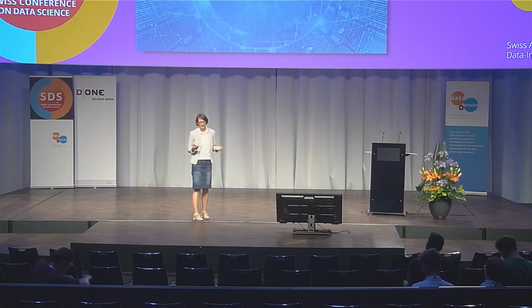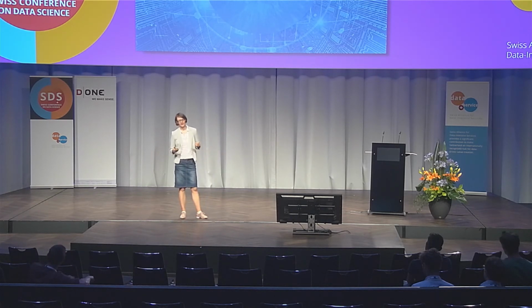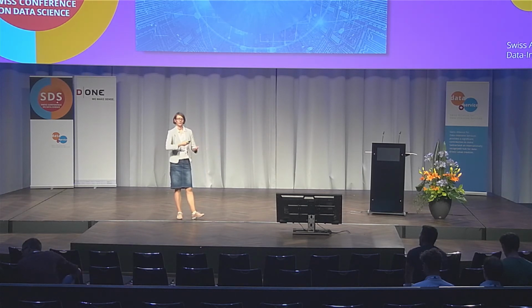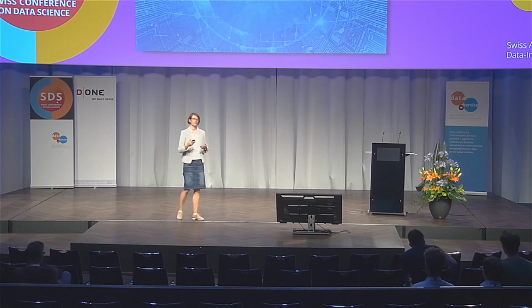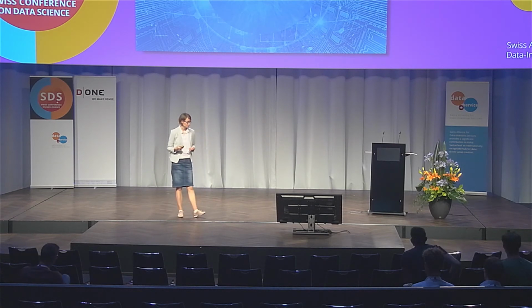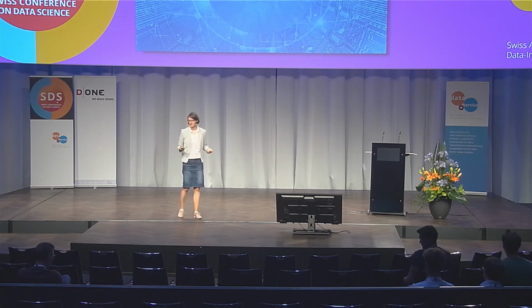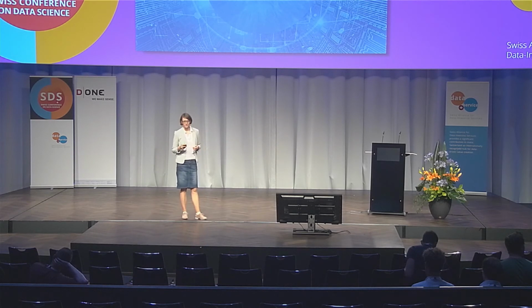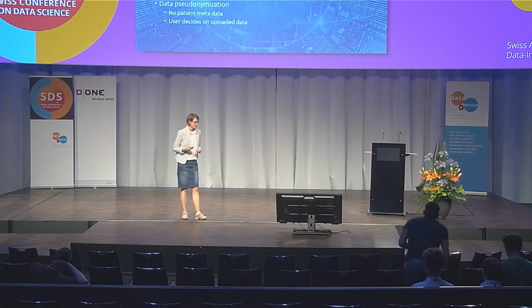We also realized it's very important that we have a versioning of our segmentation output. If ophthalmologists generate data, and then they have it with them, but maybe next time we have an updated version, they should still be able to compare their results. And then we decided also for cost reasons and maintenance reasons to go for the cloud and use existing services.